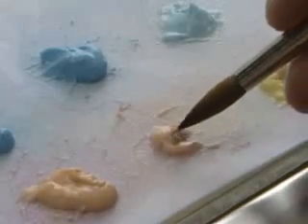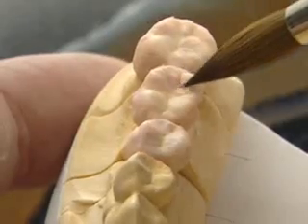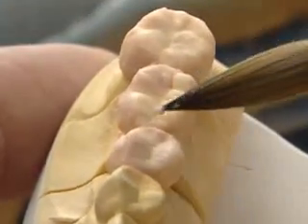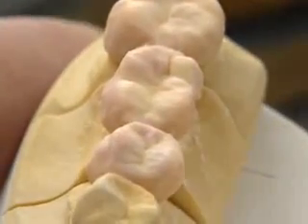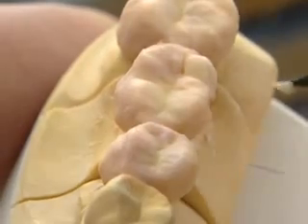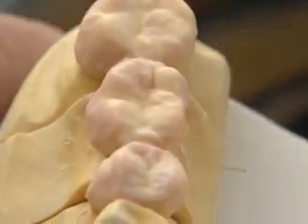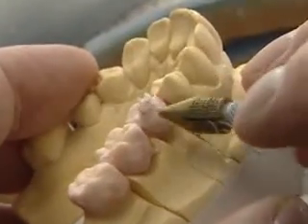The dentin build-up takes place in the standard manner; anatomical details are only implied. With the appropriate instrument, the dentin build-up can be reduced for the layering of the enamel.